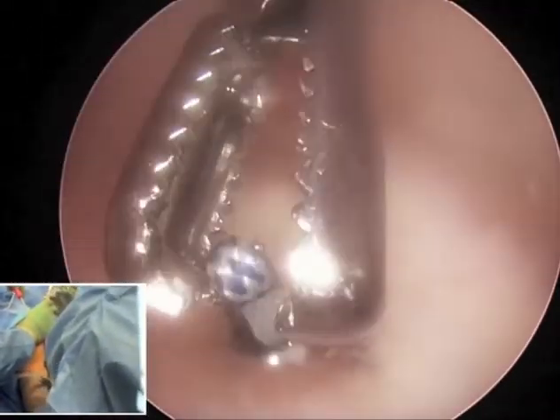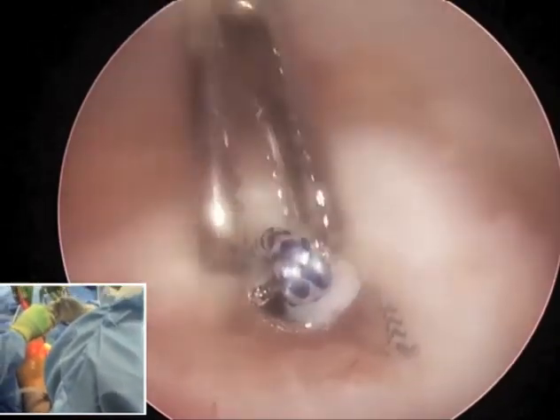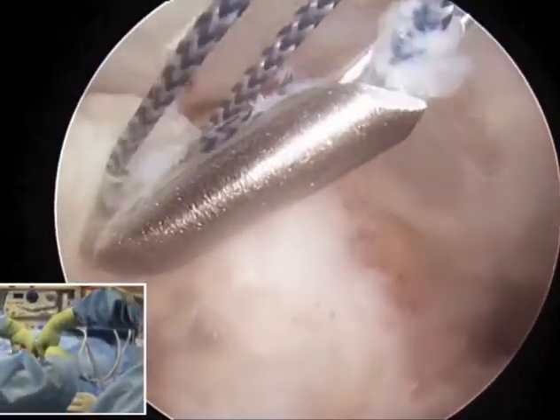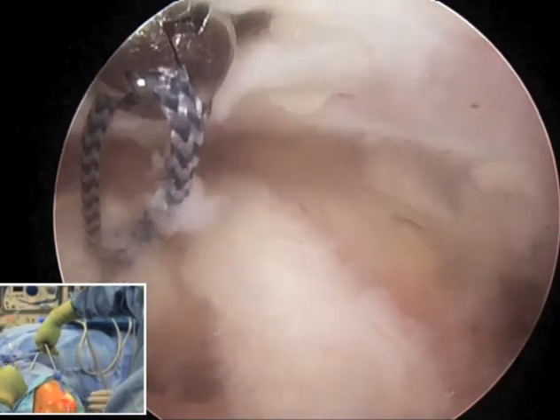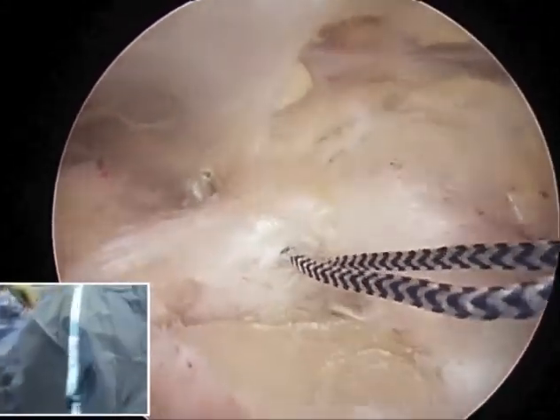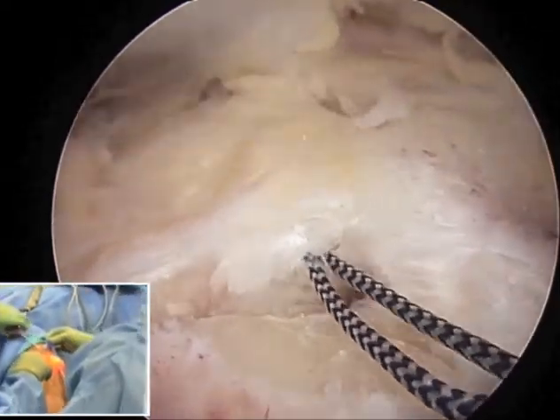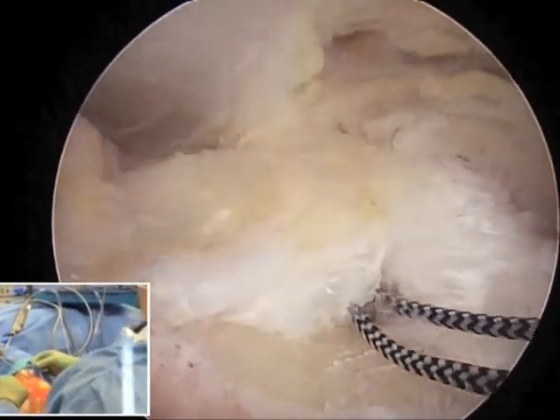This is done using a regular grasping device. Once we grasp our suture we can disengage the retrograde retriever as seen here. The retriever is then pulled back out this proximal portal and then back into the joint to grab the more peripheral aspect of the tendon and bring one limb back out, allowing us to create a tension band fixation.